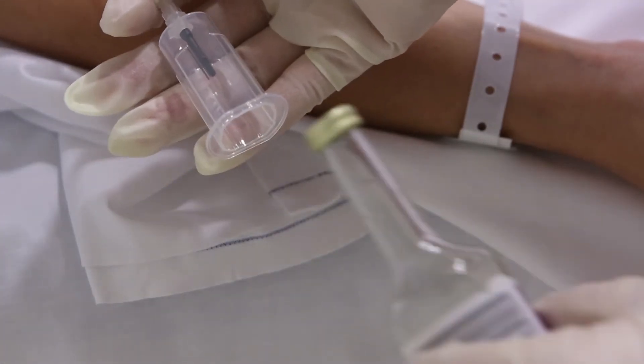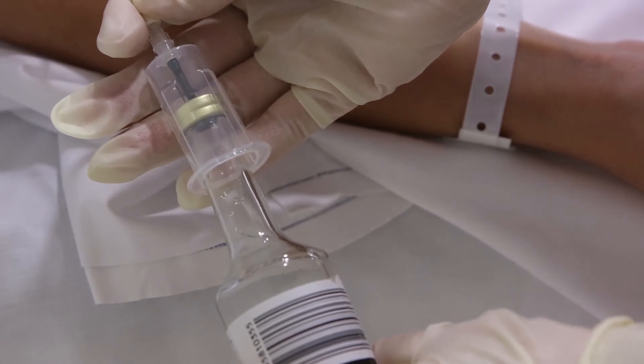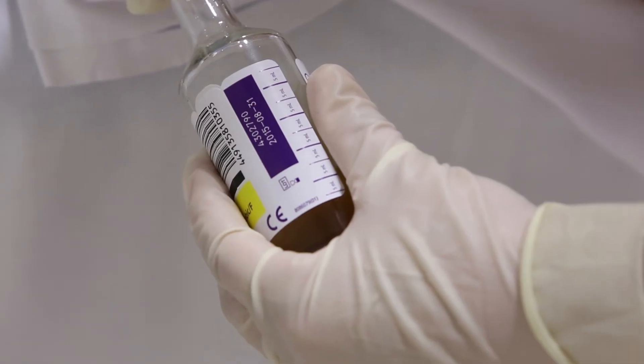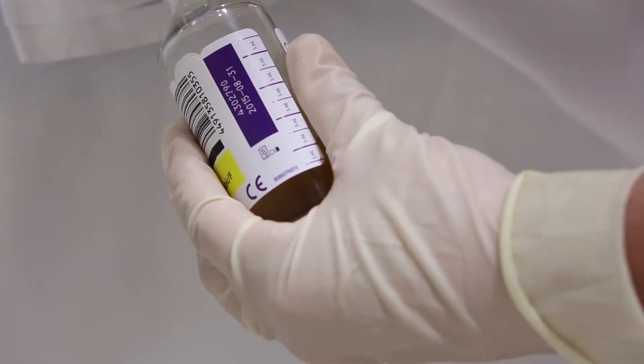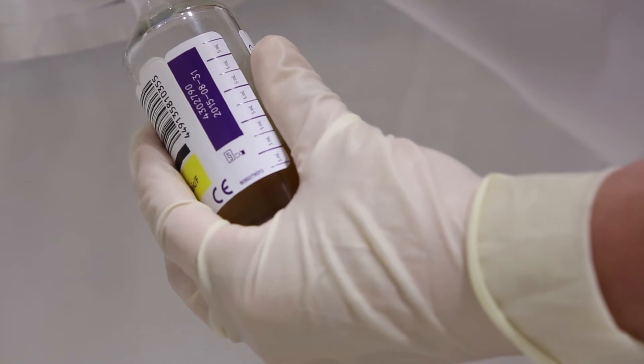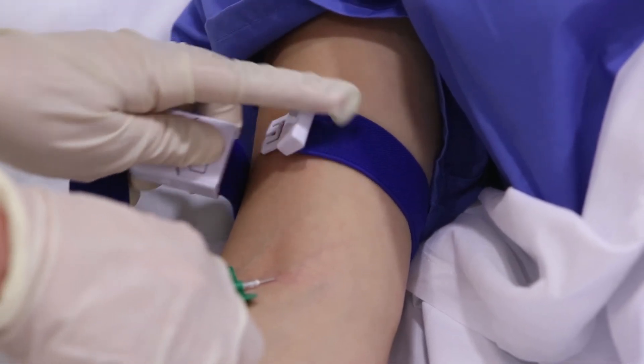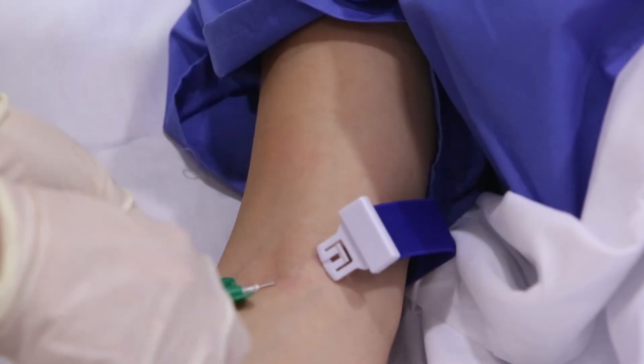The blood culture volume to be aspirated into each bottle is crucial for the detection of bacteremia and will vary according to the type of blood culture bottle being used. Further information on the required volumes can be found in the infection control blood culture policy on the hospital intranet. Proceed to fill any other bottles or tubes as needed and release the tourniquet.